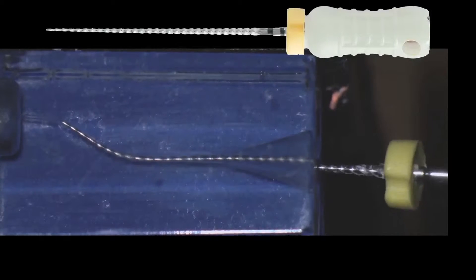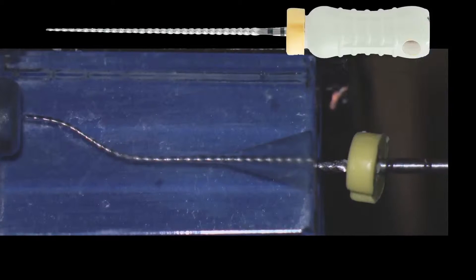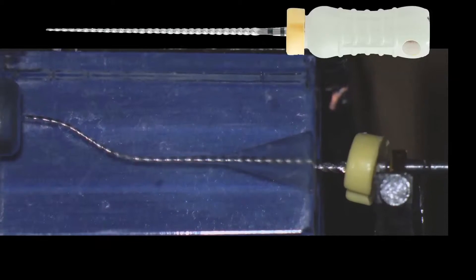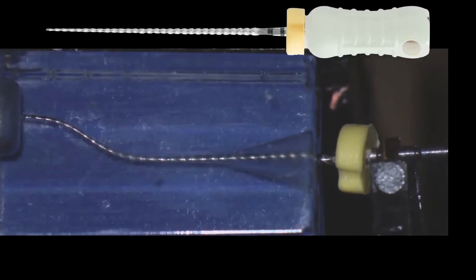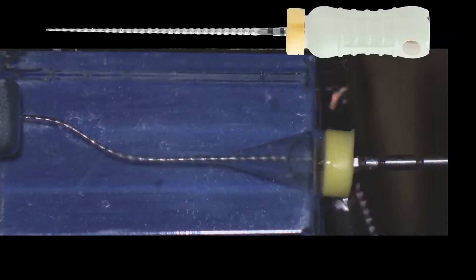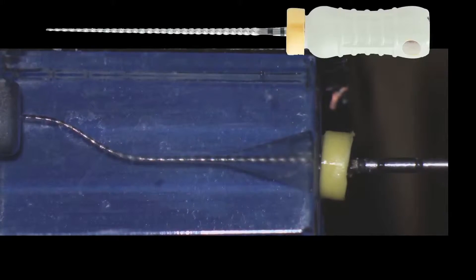Now we establish the working length. The instrument is very, very tight — we are almost at working length. We attach a clip for the apex locator. You are going to hear it when it gets to the apex. That means we have achieved that vertical dimension with the electronic apex locator. We adjust the rubber stop, take the file, and now we have acquired the working length. We measure that and record that.